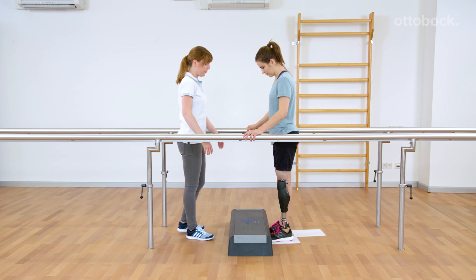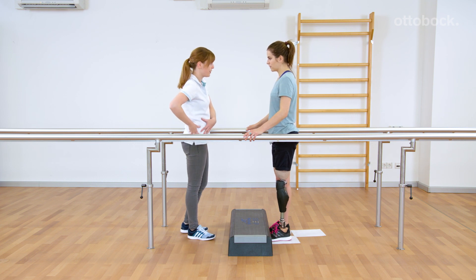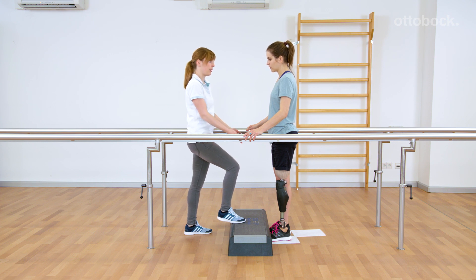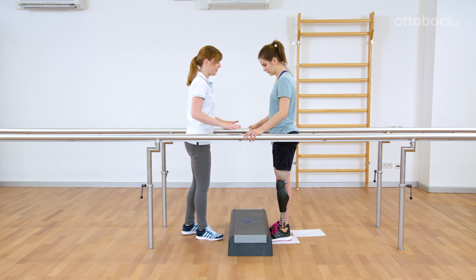Users struggling with the movement pattern usually do not load the prosthesis enough before initiating the movement pattern. This is shown when the user does not whip the sheet of paper backwards.